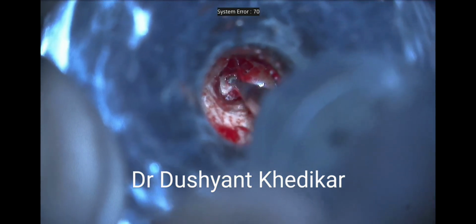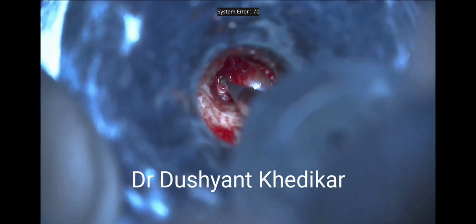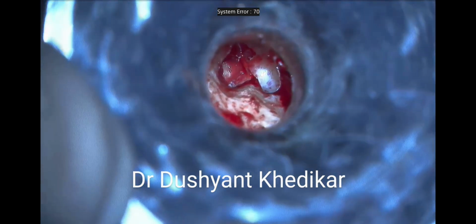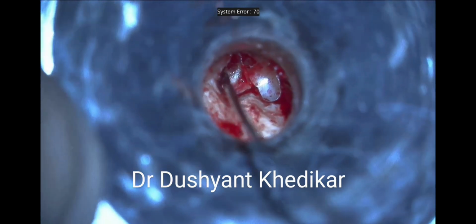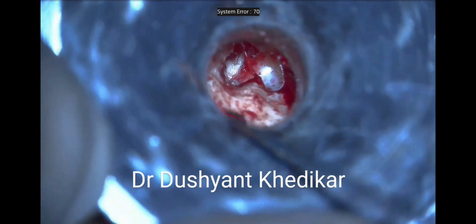Dry drilling as well as prolonged drilling is strictly avoided. This will prevent the heat generated during the drilling process, thereby minimizing the thermal damage to the labyrinth and thus preventing the post-surgical iatrogenic sensorineural hearing loss. Periodic suctioning ensures the uniformity of saucerization being carried out.